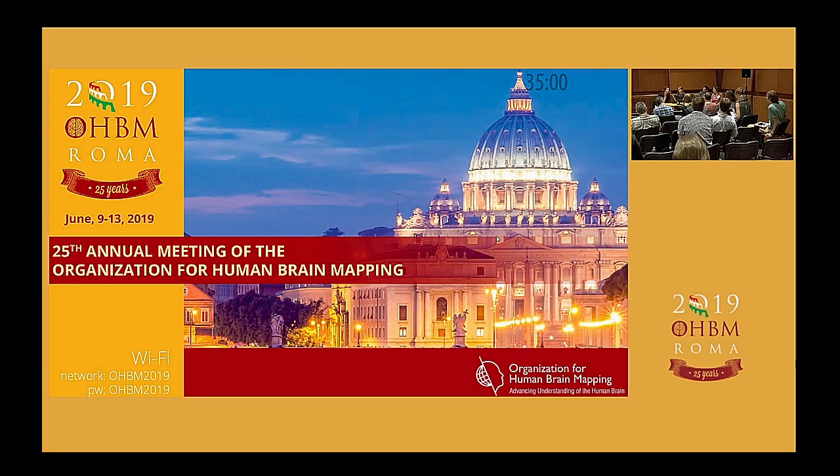There's a general guideline, I think, where you say that your motion shouldn't be more than twice your voxel size. This is a rough rule of thumb that applies for some of the 3 Tesla fMRI studies. So you look at your voxel resolution and at how much motion you're able to tolerate. But it also depends a lot on the related artifacts that come with the motion.